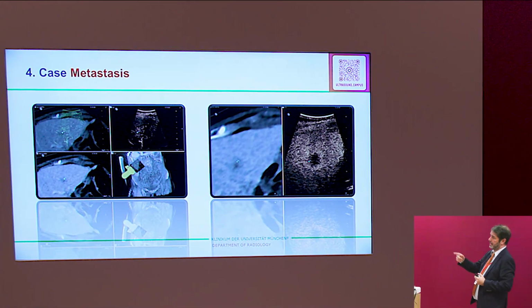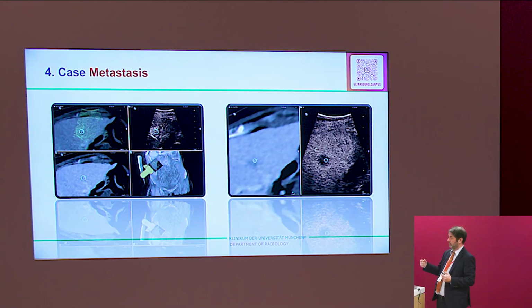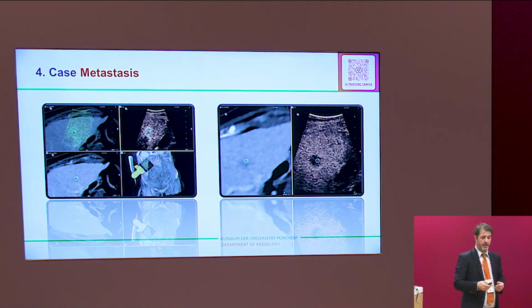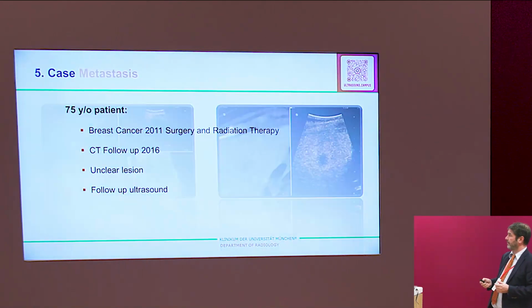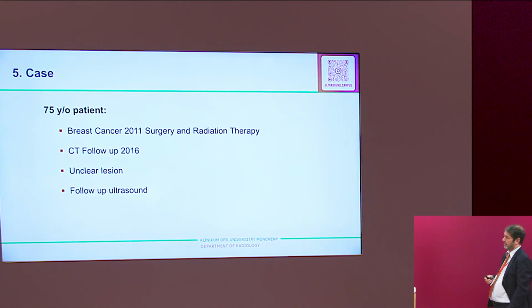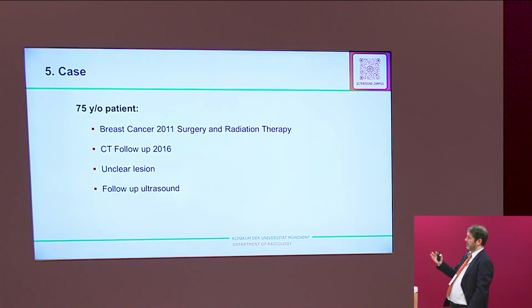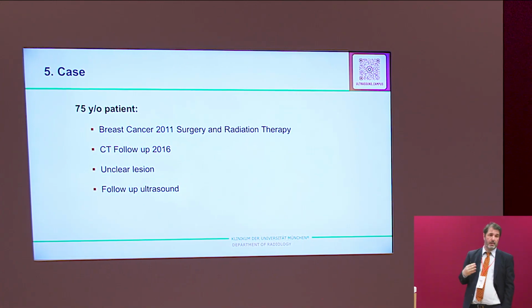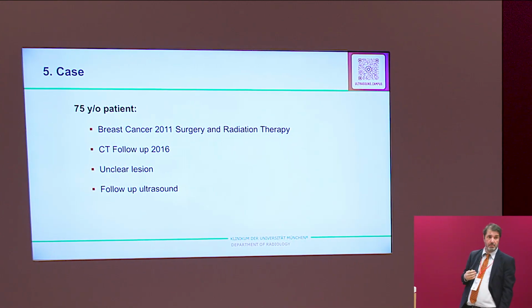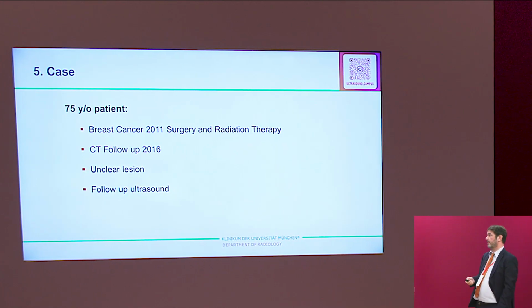You see uptake and later washout. Unfortunately, small liver mets. This patient had got breast cancer. She underwent surgery and radiation therapy. So she received 5 years later also a CT, where an unclear lesion was detected. Again, the patient came back to ultrasound.